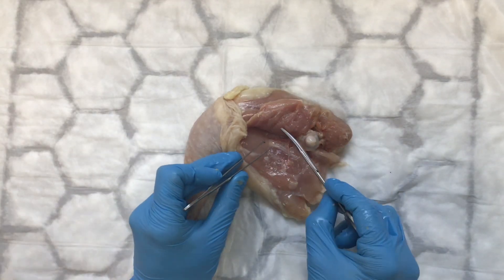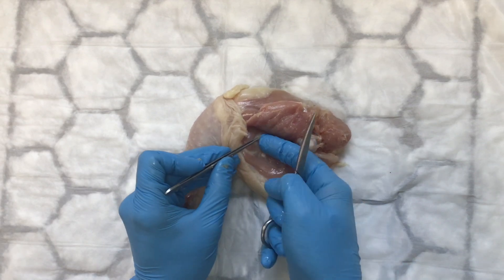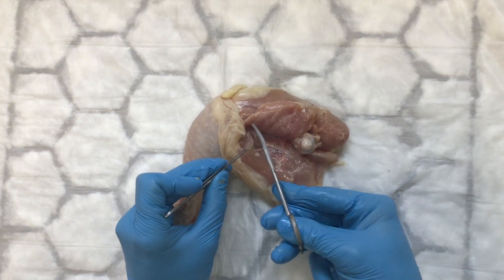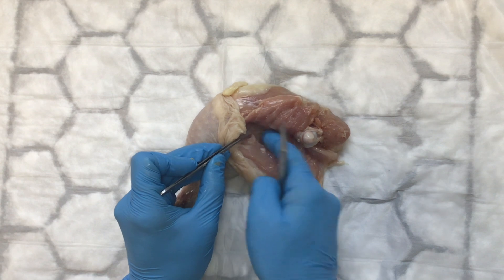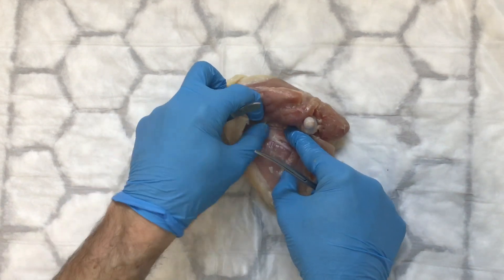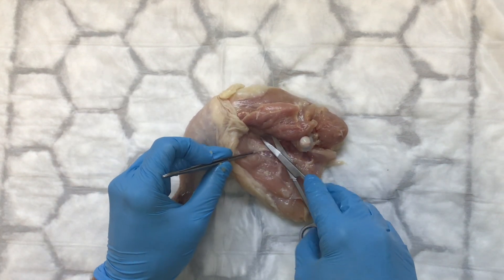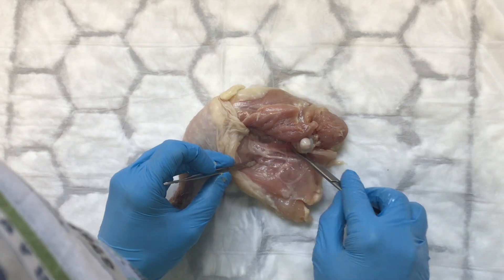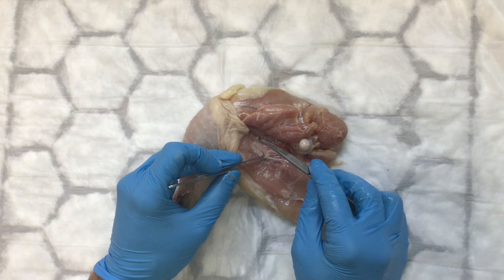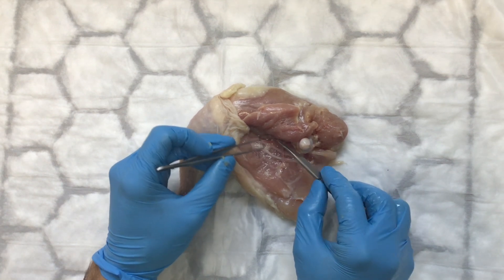What we need to do is to lift up this tissue here. Finger dissection is good — create that space, separate that muscle off. I believe that's the nerve, this is the artery here, and this is the vein next to it.